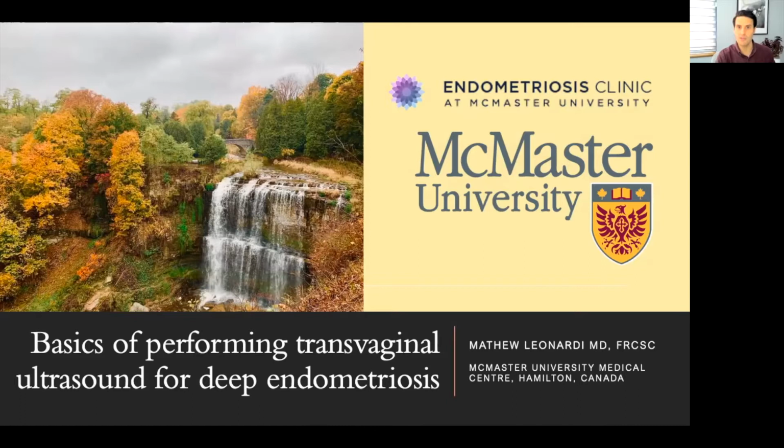I'm honored to be invited today by Drs. Falcone and Co. to this incredible controversies meeting on endometriosis, fibroids, and adenomyosis. Today, I'm going to be speaking with you about the basics of performing transvaginal ultrasound to diagnose endometriosis. This is going to be a very instructional, prescriptive talk.